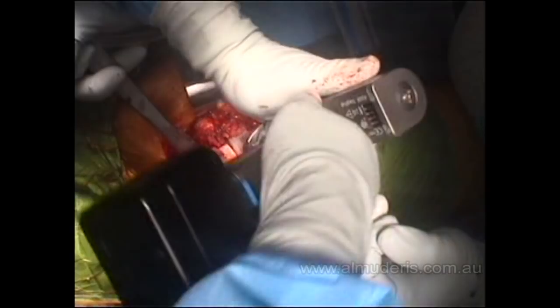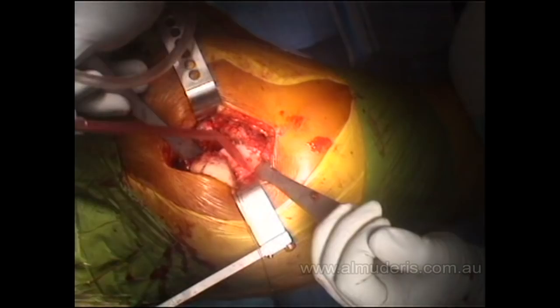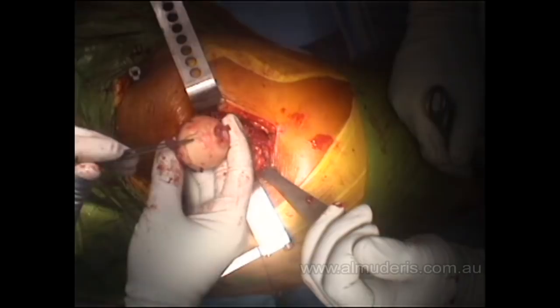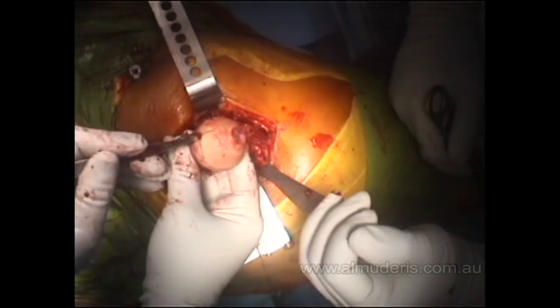The femoral neck is resected and the femoral head is removed. This is clear damage to the femoral head — you can see the area of avascular necrosis that has collapsed, and you can see that the knife goes through the collapsed area very easily.